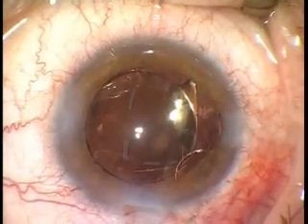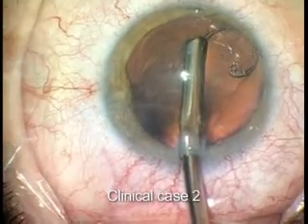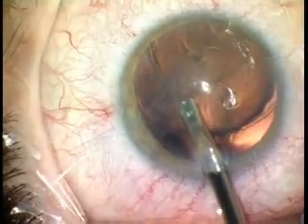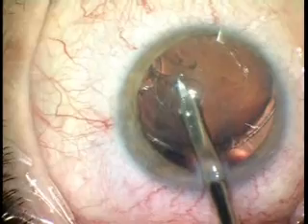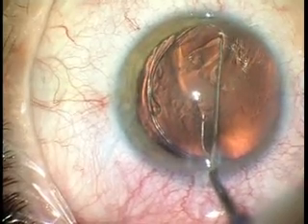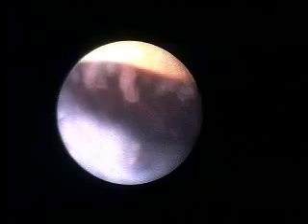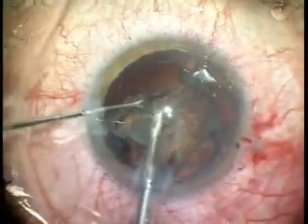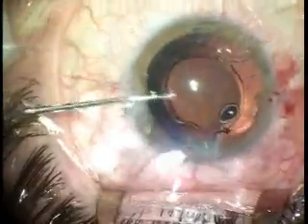The typical T-drop shape of the capsulorrhexis points toward the location of the sutured scroll. In the following video, the CTR is implanted in a patient with a traumatic zonular defect and mydriasis. The fixation element is rotated towards the area of the zonular weakness with a hook. The ciliary sulcus area is examined with endoscopy. Once the ring was secured to the scleral wall, the procedure became routine. The lens was removed by microcoaxial phaco, the IOL is then placed into the capsular bag, and the procedure is finished without difficulties.